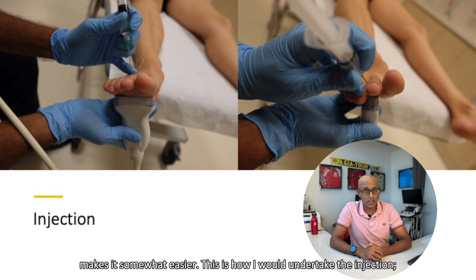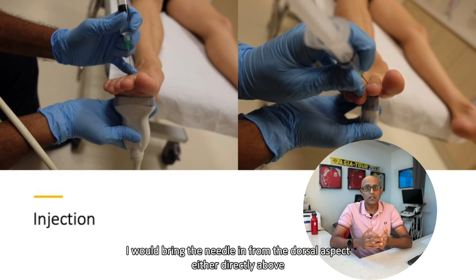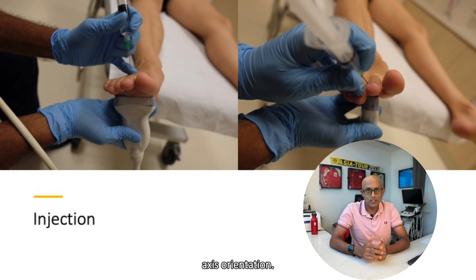This is how I would undertake the injection. Using a linear transducer placed either in a short or long axis orientation on the plantar aspect of the foot, I would bring the needle in from the dorsal aspect — either directly above if using the short axis orientation, or at a slight tangent between the toes if using the long axis orientation.